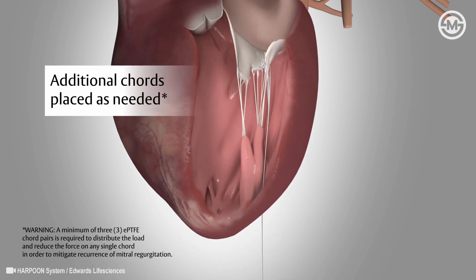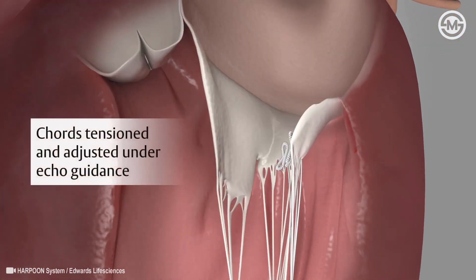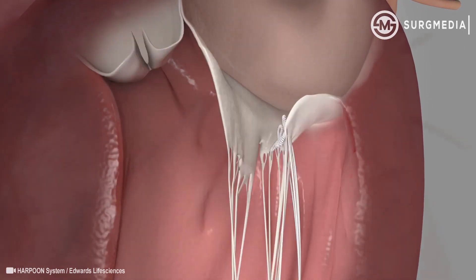Once the proper number of cords are placed, the device is removed and the cords are tensioned. All cords are then adjusted while the heart is still beating. When the cords are tensioned, the two leaflets are realigned, repairing the valve so it can open and close properly.